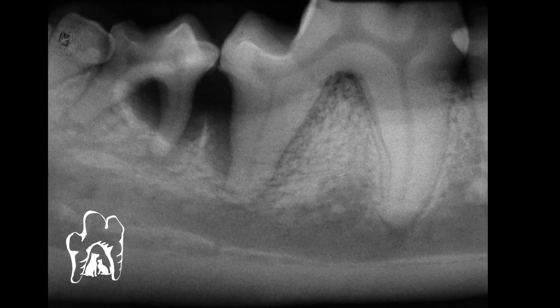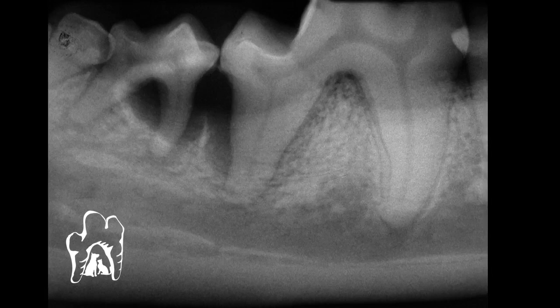Even if it's not that bad, we want to extract that. That also accomplishes exposing that area better so we can see down in there and clean that defect much more readily.